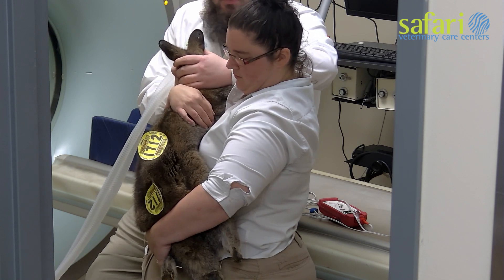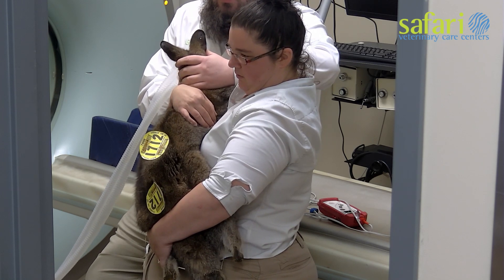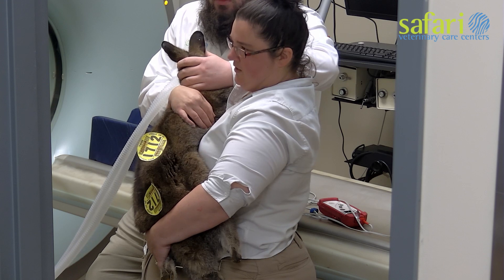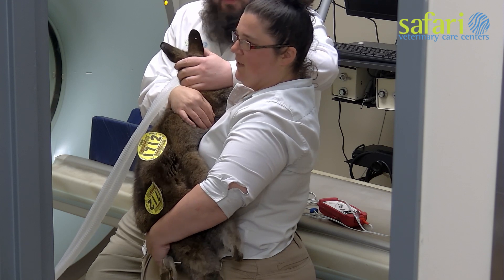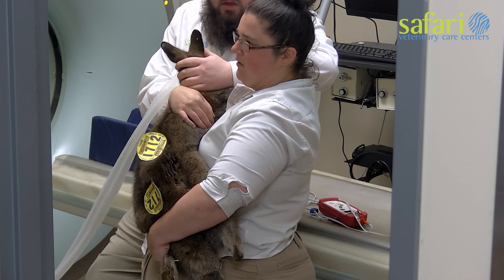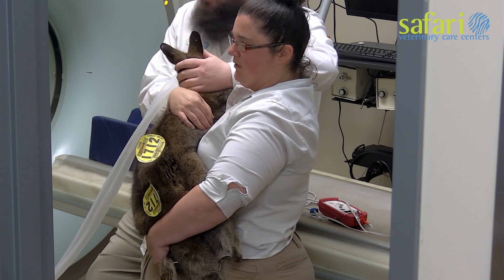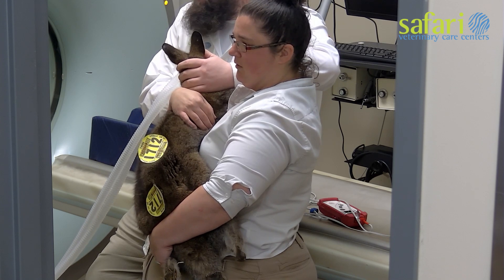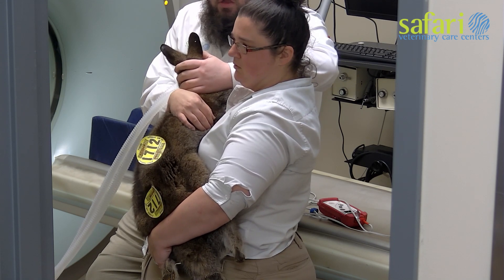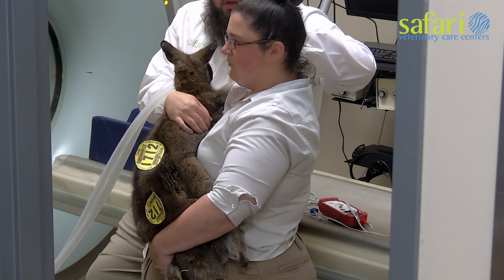When administering gas through a mask like this, initially it feels good, but later the animal realizes it's losing control of its functions and goes through a panic stage. Melinda, our stem cell liaison, is assisting with this, and this short panic stage will lead to anesthesia necessary for the CT scan.